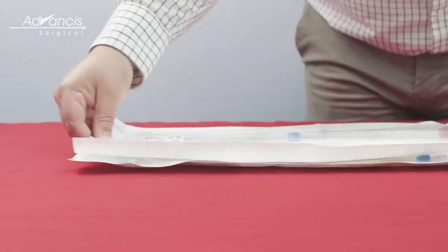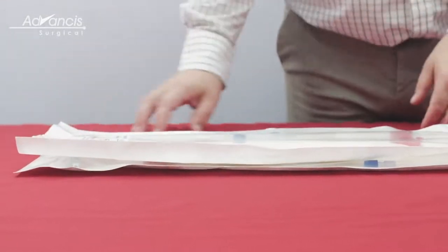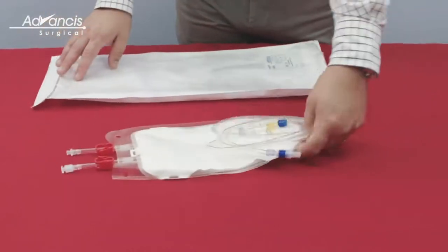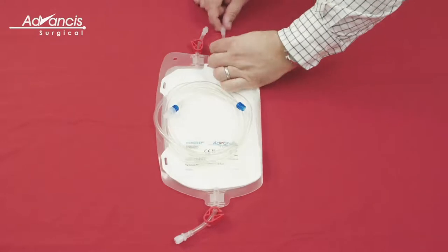Open the Hemosep cell concentrator kit and remove the two bags from the box. Open the cell concentrator bag. Close clamps B and C.